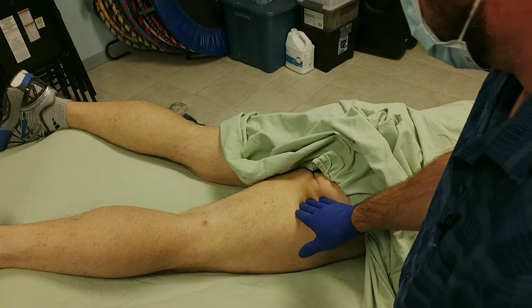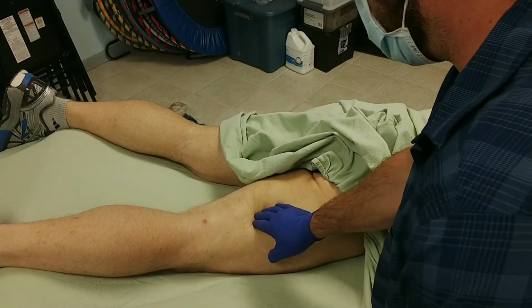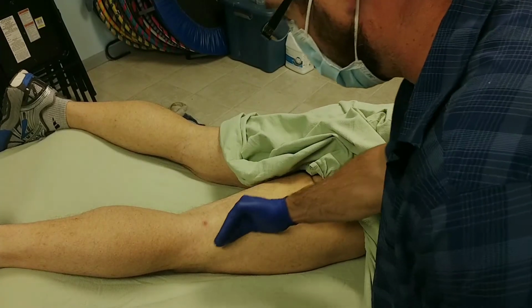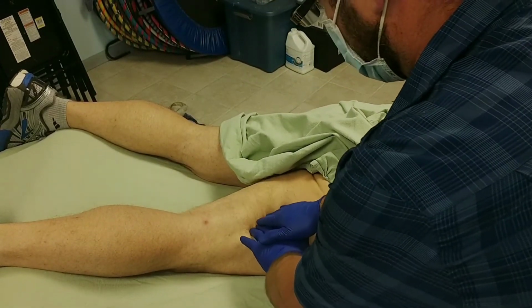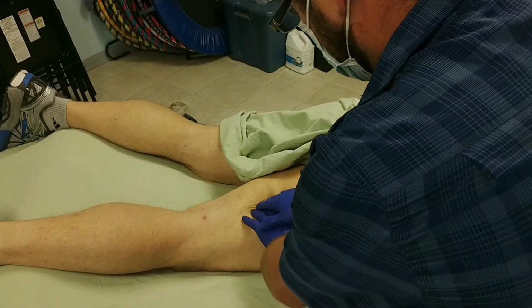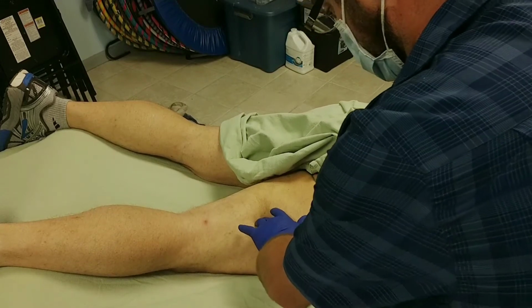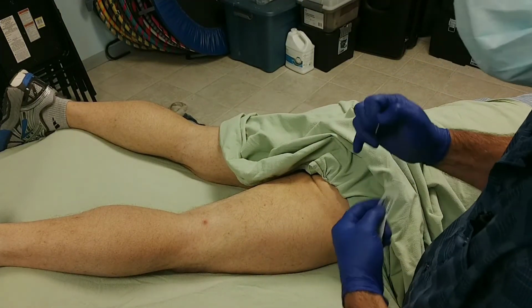For palpation, I usually am using a simple flat palpation and strumming across the fibers. So if I'm thinking about biceps femoris, I'm going to strum like this and look for tender spots, the taut bands right in here. There's a pretty good one in here. So grab ourselves a needle.